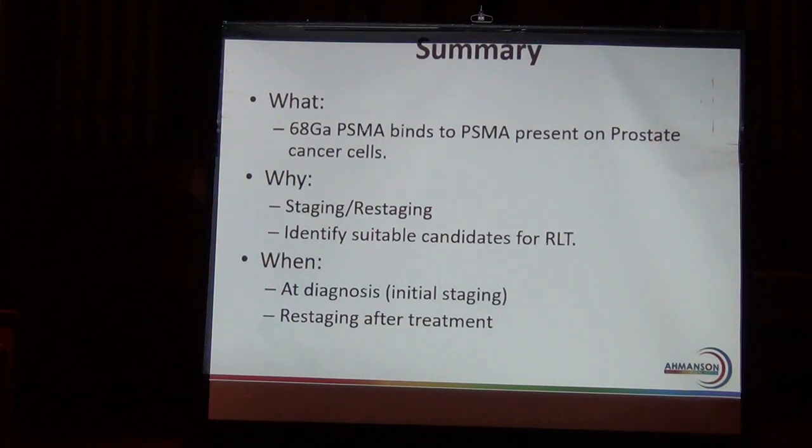When do you do imaging? Well, you do it usually at diagnosis for initial staging. And then you want to restage after treatment, especially if the PSA disappeared after initial treatment and now the PSA is coming back. You want to know how extensive the recurrence is to decide on the best course of action.